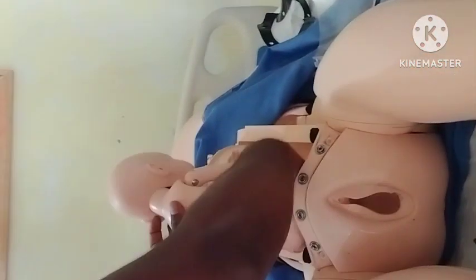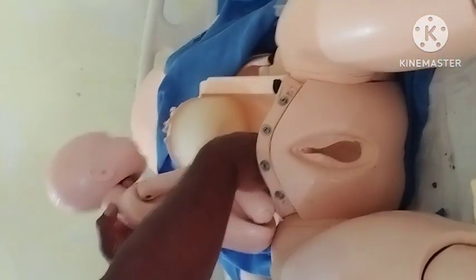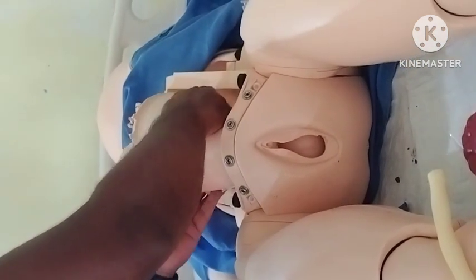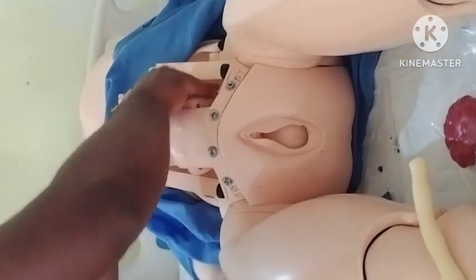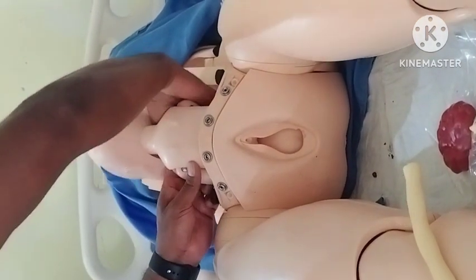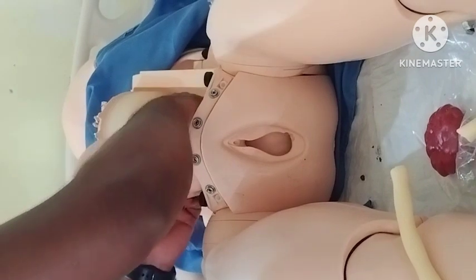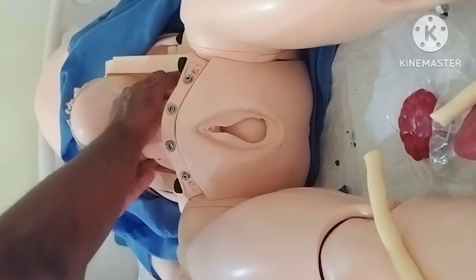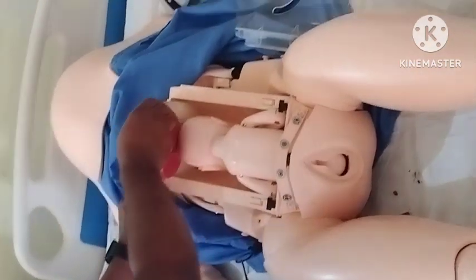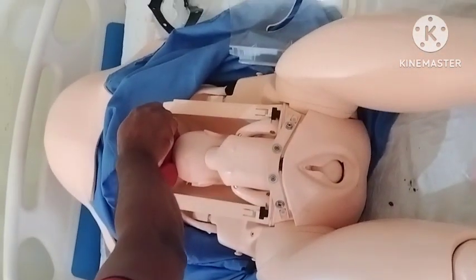Keeping the baby like this. So again, lubricate it nicely. Basically, when you keep the placenta, the placenta will come here. So basically the placenta will be above the head like this.